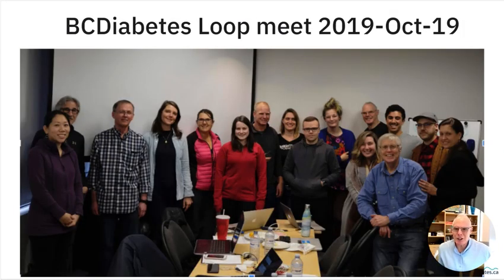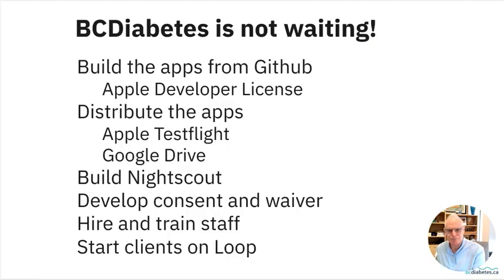Well, in 2019, actually 5 years ago to this day, Ben suggested that I host a loop meet at BCDiabetes. And here you can see a group of people, about half of them had been on Loop before and knew how to use the software and to build it, and the other half had never used it. So they arrived at about 8:30 on a Saturday morning, and by about 4 p.m. everybody was looping. It required building a Night Scout account, which we'll talk about later, as well as building the Loop app. I said to Ben, there's got to be an easier way.